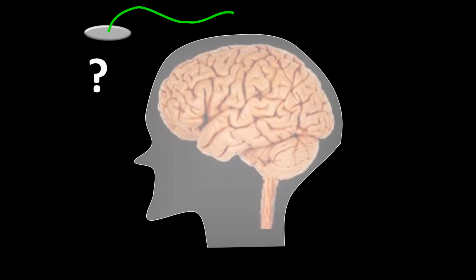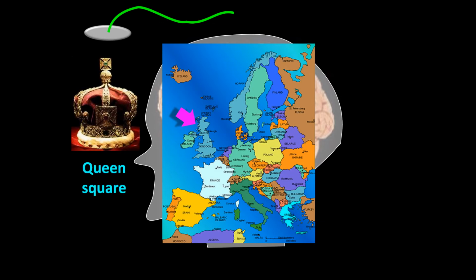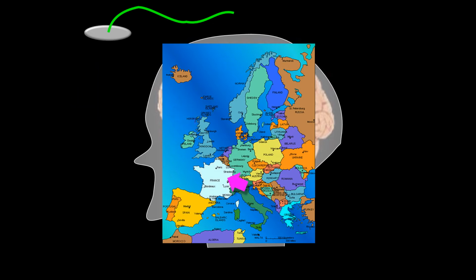Two types of montage are used for visual evoked potentials. One type is used primarily in England. It is called Queen Square. Labeled by the Academy, it has been demonstrated that this montage is superior to all the other ones being used. The other way was initially used in France and is called the 10-20 system.